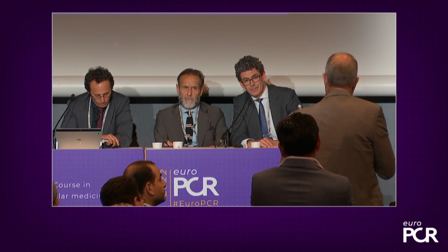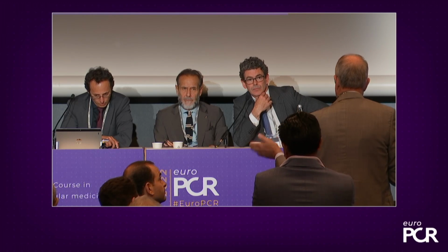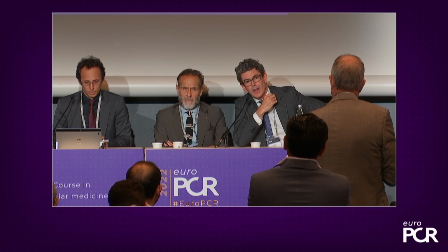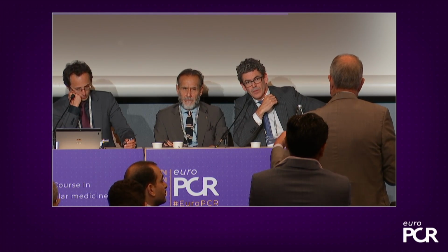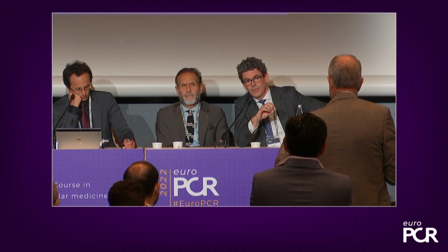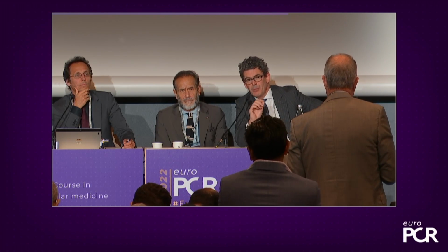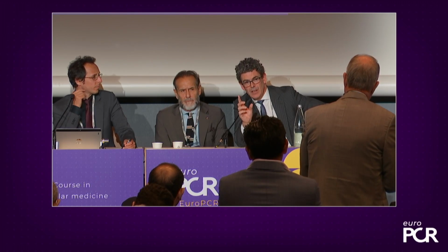I would just make the argument that we don't really know, that there's no prospective data to argue why you could not be more conservative. I think your argument's based upon thinking that the more cracks I make, the better the patient will do, when the only goal was just to change compliance acutely just to get the stent in. Once the stent's in and it holds the benefit, then I don't know what the additional benefit is of doing additional cracking.